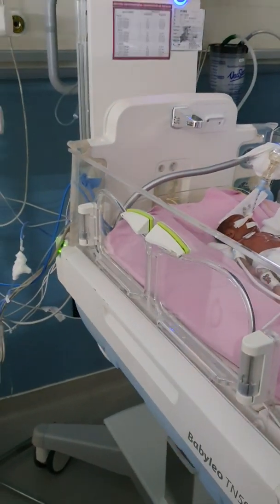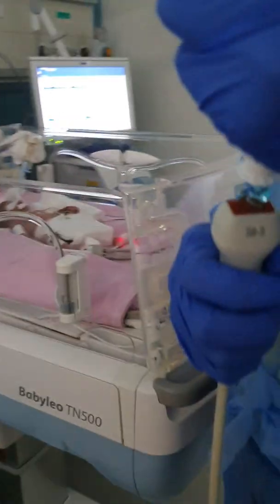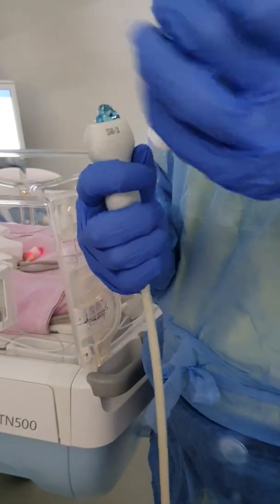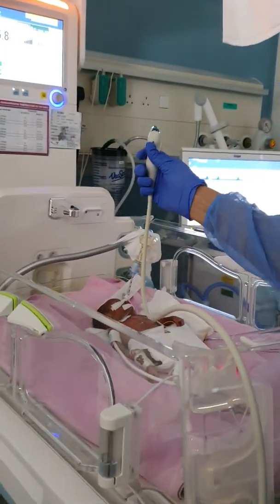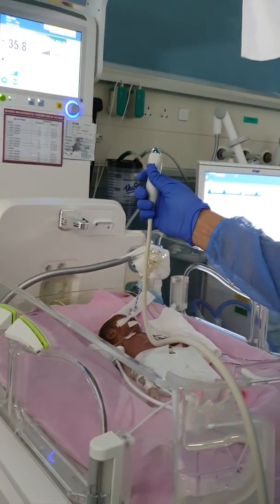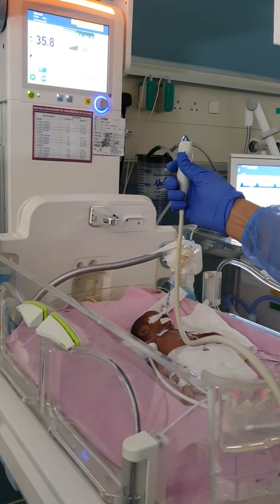So first we use the gel. When you use the gel, try to make it a little bit hot for a period of time. Warm it up so the baby doesn't get discomfort.